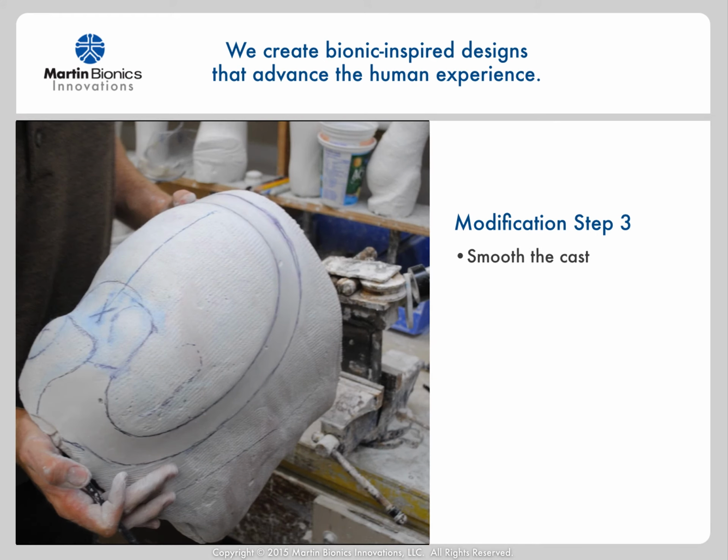Most of our modification is already done. Now let's just smooth the cast within our trimline areas, and then we'll move on to the shoulder joint attachment area.